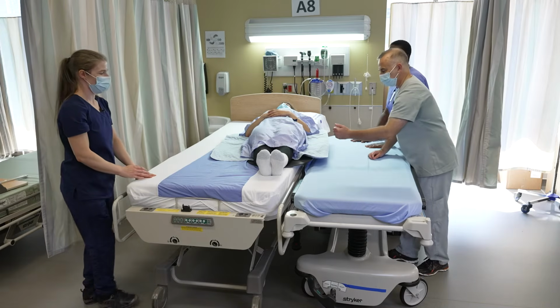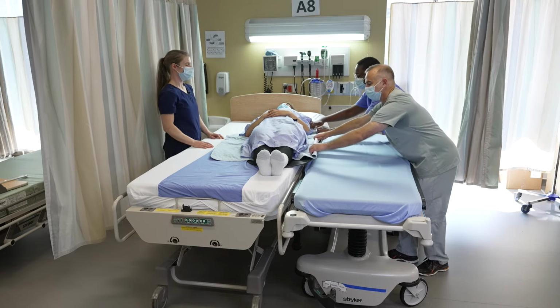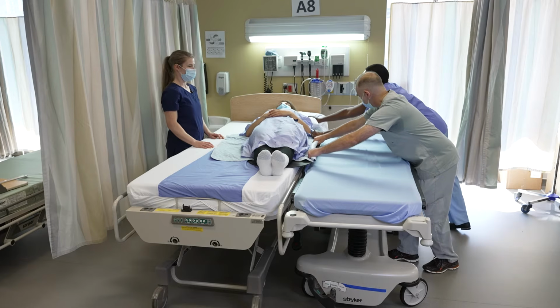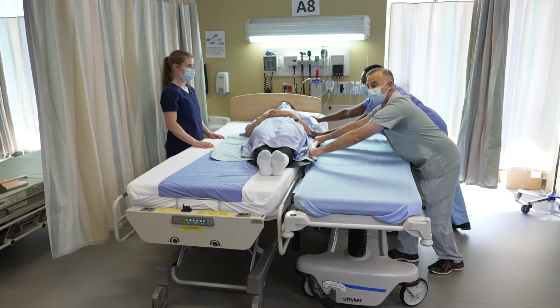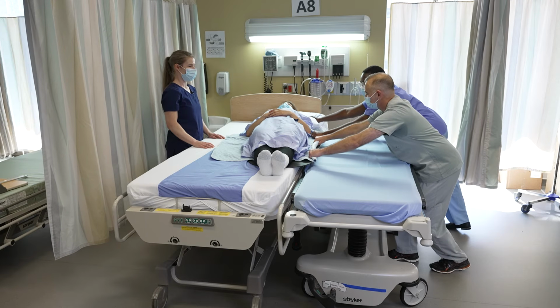Catherine will move the feet closer to the side, as she has just done, and we'll use a similar hold and weight transfer as we did earlier. So I hold the PK with 2 hands, and Anne-Marie has the PK and the pillow, and on 3, we will do a forward-backward weight transfer towards us. 1, 2, 3.